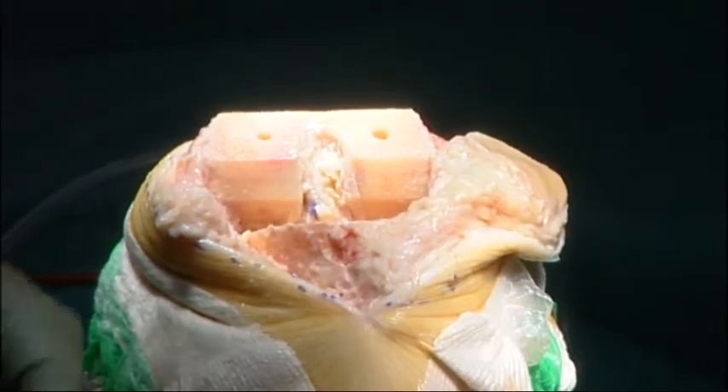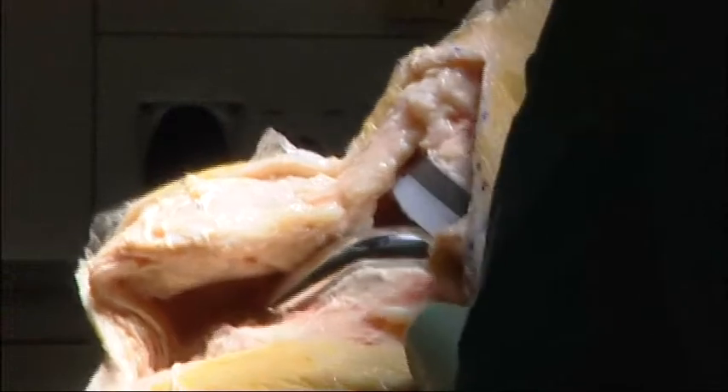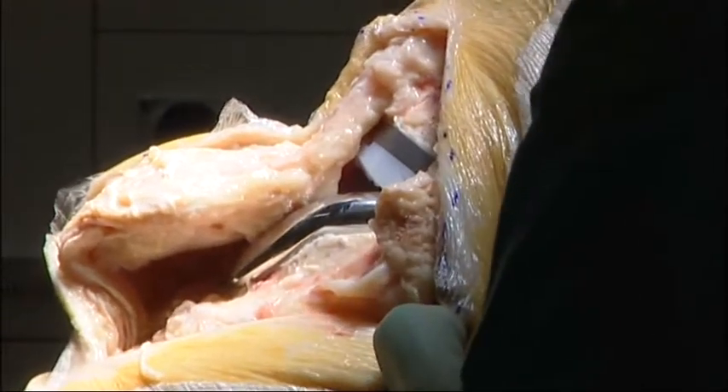On a knee that has been perfectly replaced, the joint line will have been returned to the correct level — the level of the menisci. To replace the whole joint, the tibia and patella are resected with a single cut each.